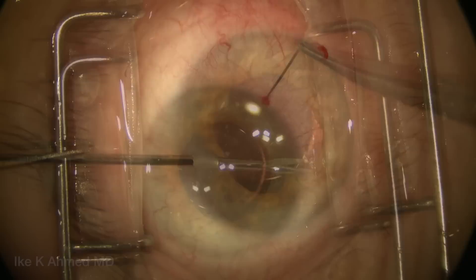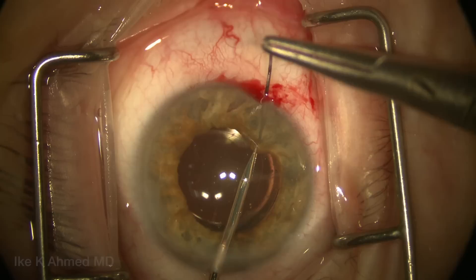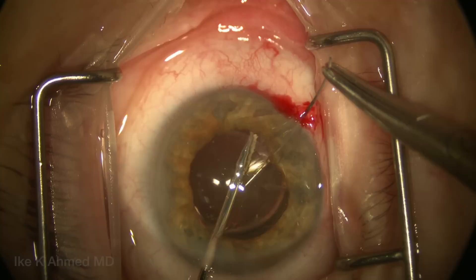Here a 10-0 Prolene on a curved CIF-4 needle is placed through the nasal paracentesis. The micro graspers are used and we're going straight down through iris tissue here, directing the needle into the central anterior chamber space. Notice the direction of the needle during initial placement, and then we will direct the needle in this case toward the nasal quadrant.